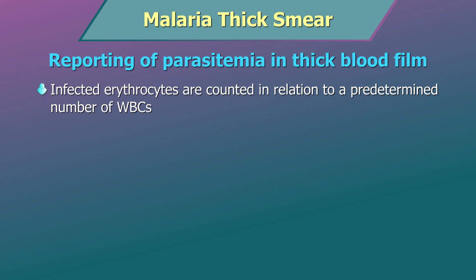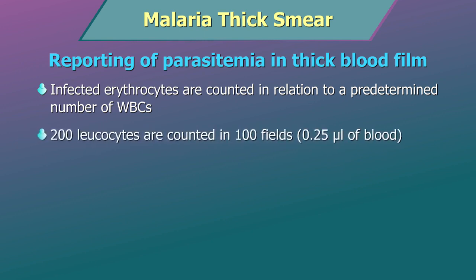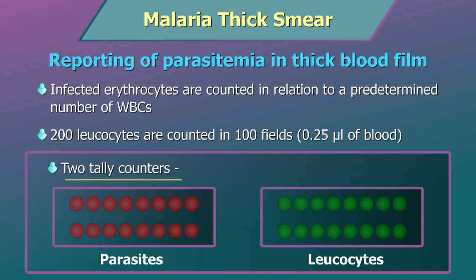Infected erythrocytes are counted in relation to a predetermined number of WBCs, and an average of 8,000 per microliter is taken as standard. 200 leukocytes are counted in 100 fields. All parasite species and forms, including both sexual and asexual forms, are counted together. For this, 2 tally counters are required, one to count leukocytes and the other to count parasites.